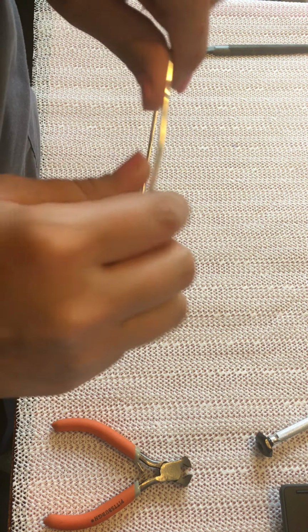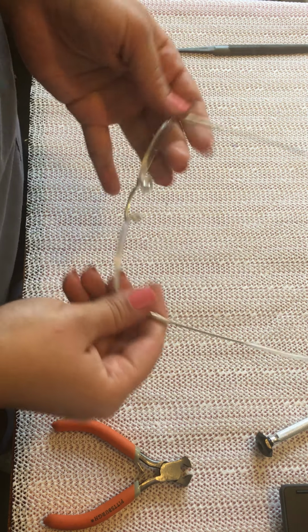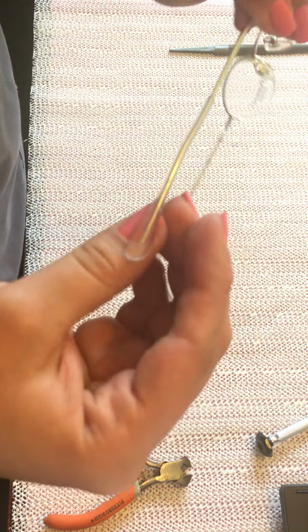On a patient, it would depend on the back of their ear, on where their ear is. So I'm going to use my thumb as my tool. And then I would hold it with my other thumb, and then I would just curve. I would just curve like that. And I will do the same thing to the other side.